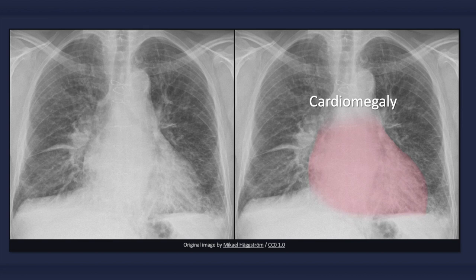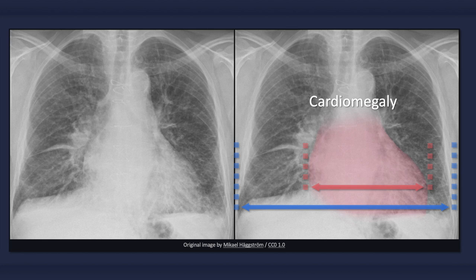Cardiomegaly, particularly in concert with other findings, is a suggestive feature of congestive heart failure. However, keep in mind that congestive heart failure can occur in the presence of a normal-sized heart. Cardiomegaly is said to be present when the cardiothoracic ratio is greater than 0.5 — that is, when the largest transverse distance between the left and right heart borders is greater than half the width of the thorax. In this image, the cardiothoracic ratio is approximately 0.6.